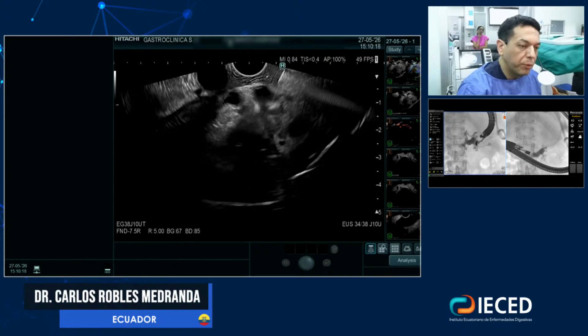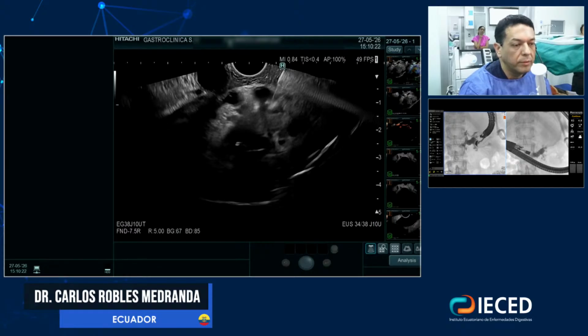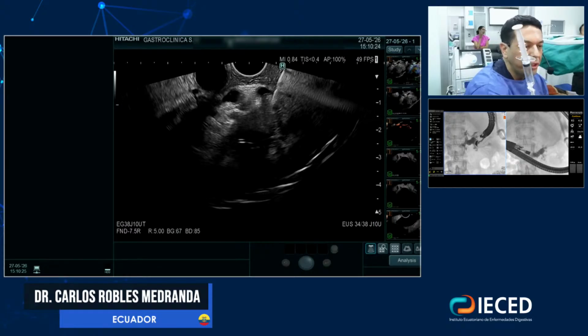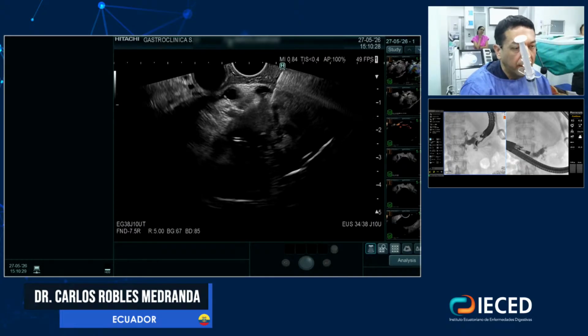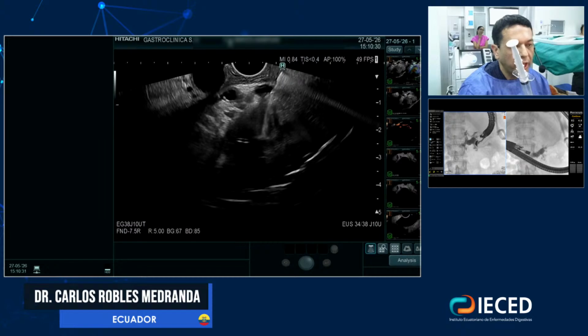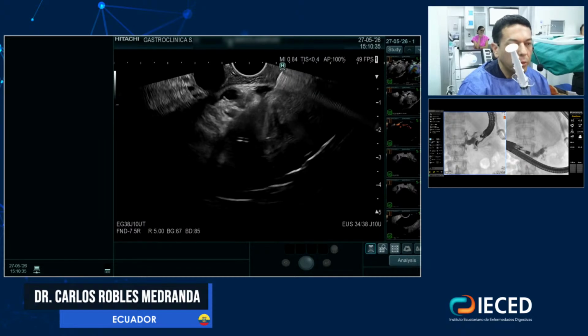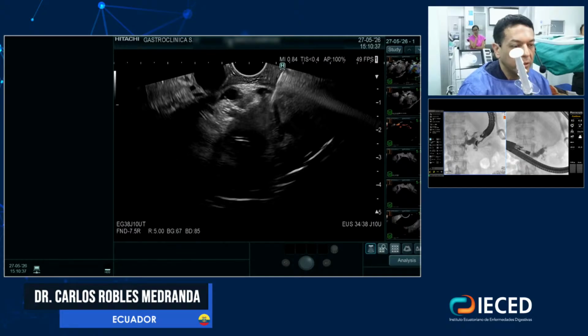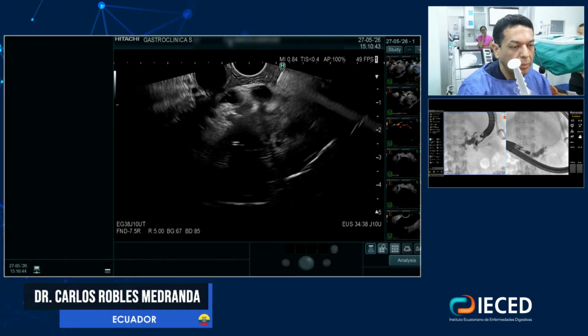That's why probably in the future the use of adaptive ultrasound machines at the tip of a standard scope for general GI will be a very good decision, and we need to change the way that we train our physicians, because in that way we can have much better diagnosis and increase it at least 30 to 40%, as has been published in other papers.